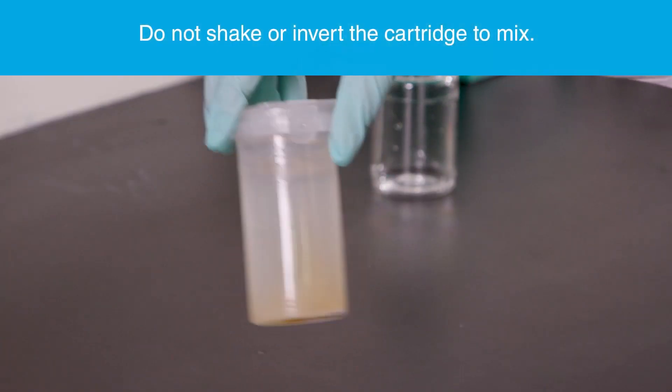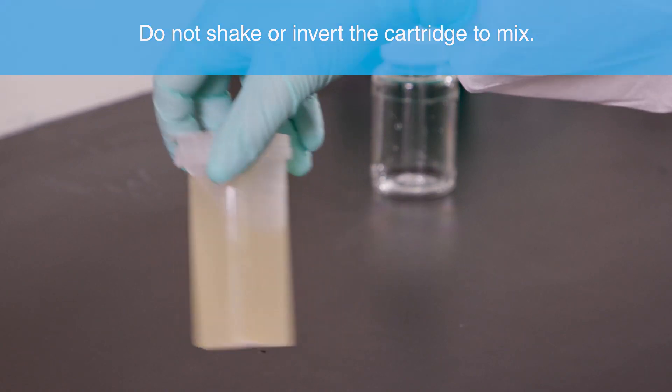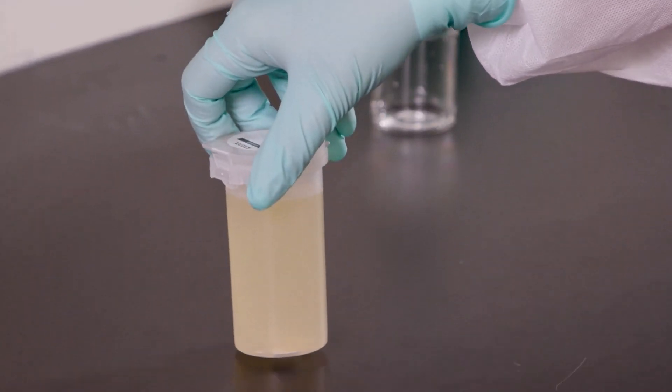Cap the vessel by either closing the lid or by locking the tamper-proof tab in place. Gently swirl until the contents are dissolved. The sample may remain cloudy after swirling, but is now ready to be tested in your TECTA instrument.